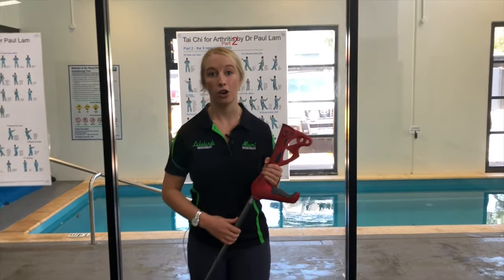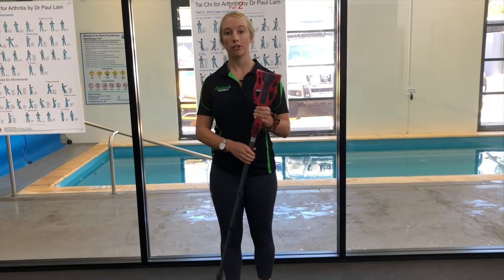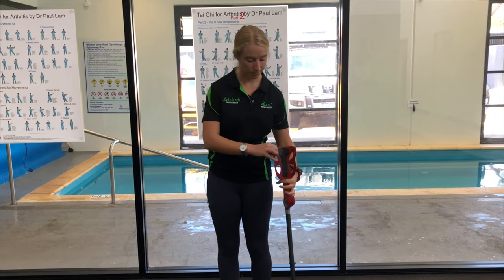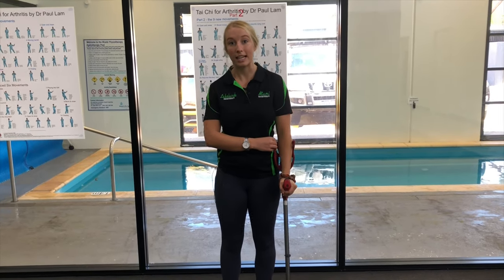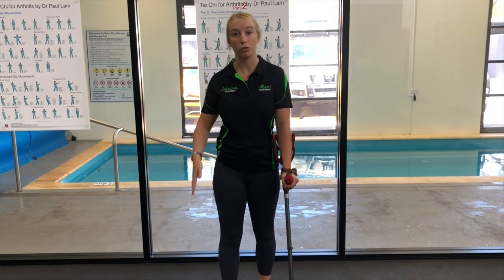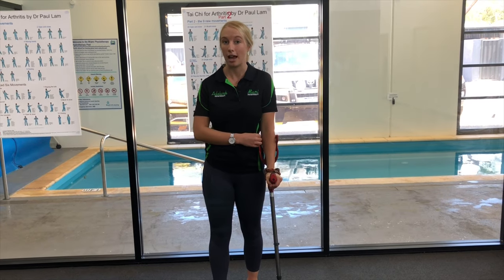For example, if I had hurt my right leg or my right ankle, I would be putting the crutch into my left side. This helps keep us nice and even so that when we have the weight through the right leg, we can keep the weight even by putting the pressure through the left side.